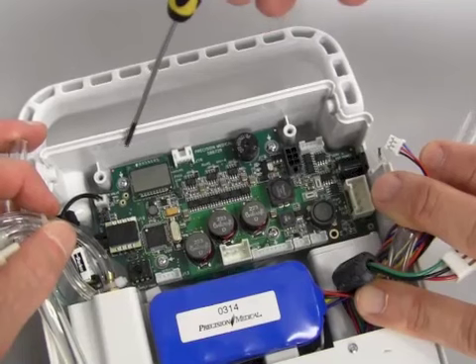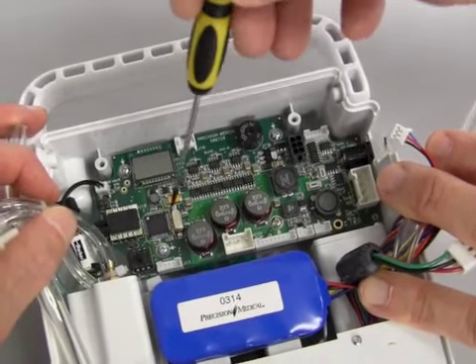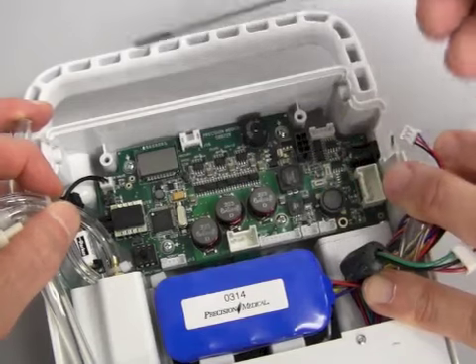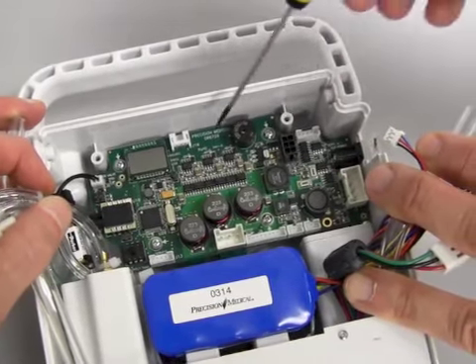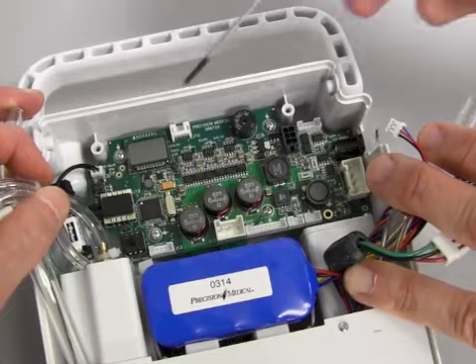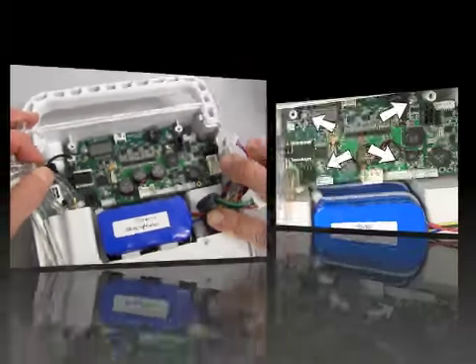The next step to remove the circuit board is you have to remove the 4 Phillips head screws, and also this plug for the valve has to be removed from the device. It's a good time to mention that when you are removing a circuit board from the POC, you should be grounded, meaning ESD protection, so that you do not apply any static to the circuit board.